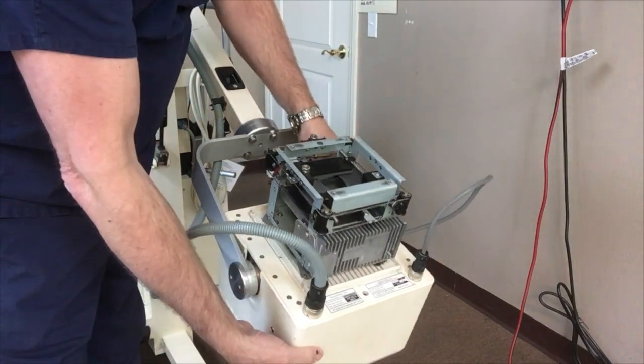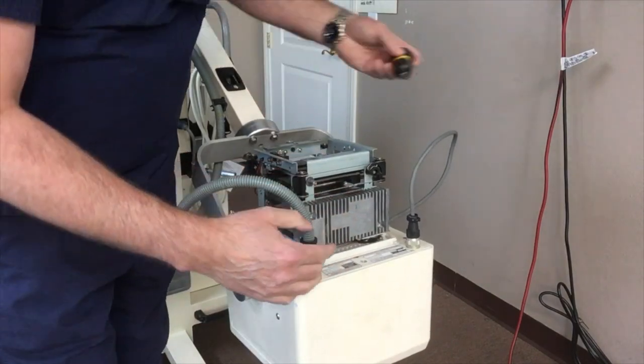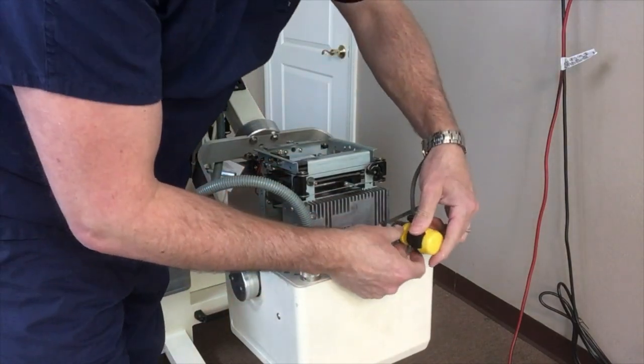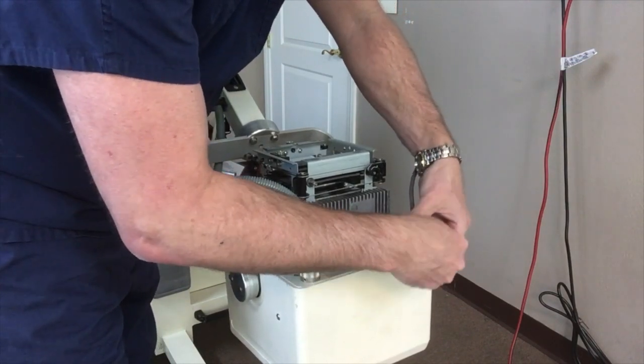Once you've got that removed, you get access to the heat sink which is right here, and the bulb is underneath that heat sink. There are two screws on the heat sink that need to be loosened.